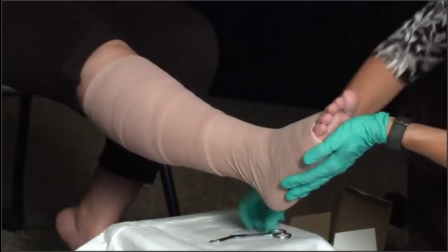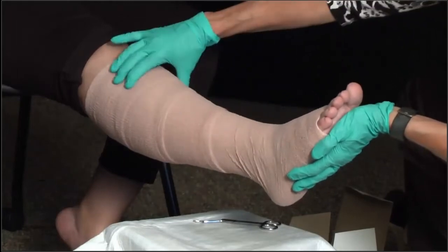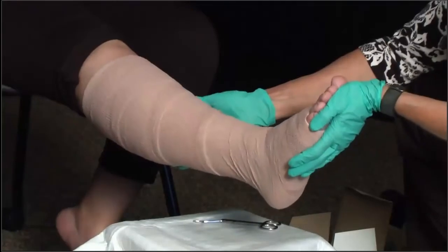So here we have an application of compression: base of toe up to knee, 50% spiral overlap. Again, what this is doing is mimicking that pressure and venous return back up to the heart.